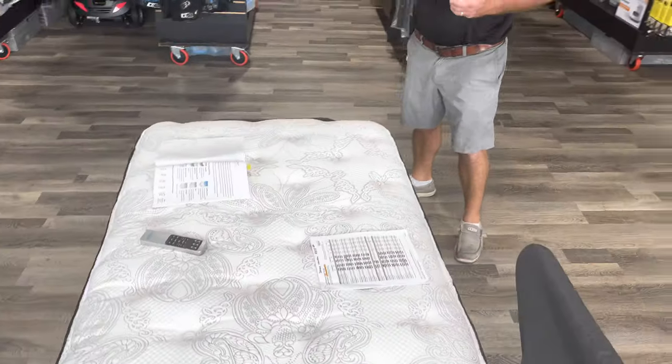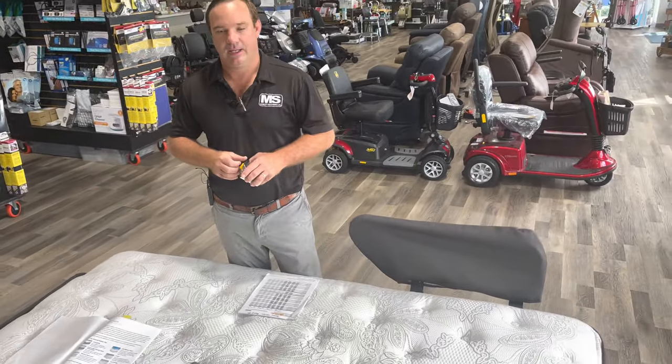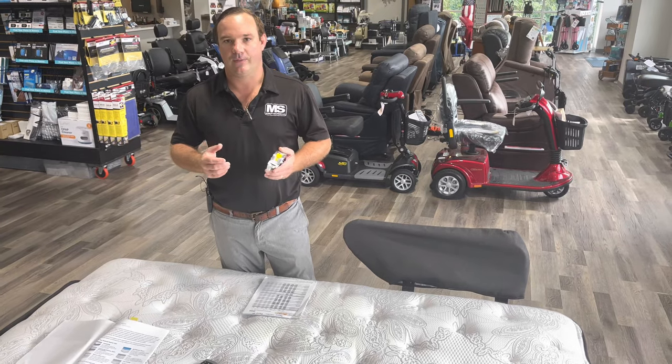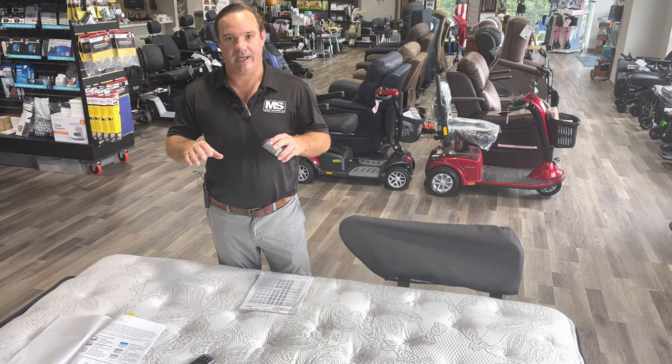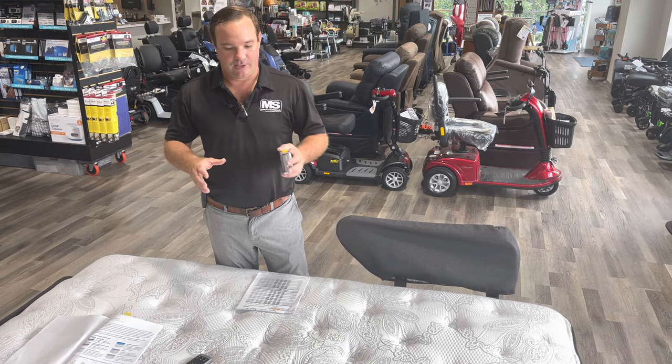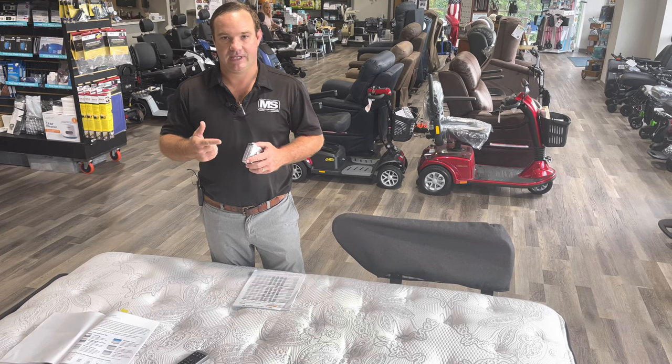If you're looking for the Flexa bed or have any questions, you can call us at 803-926-2224. Ask for Chris, or visit us online at Affordable Medical USA. Search for Flexa bed — you'll go to a page where you can look at the different beds. They offer a value series, a premier series, and a high-low.